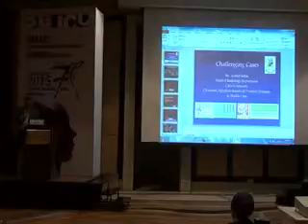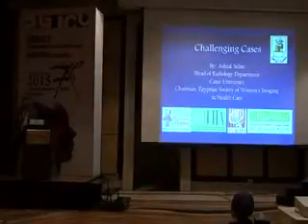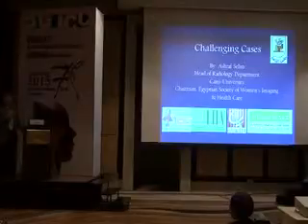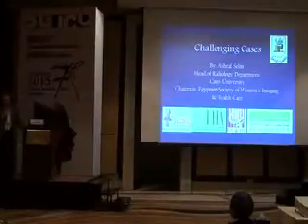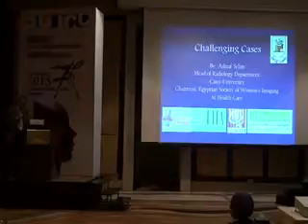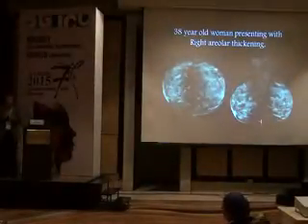My presentation today would be basically centered on the MRI, and I've heard lots of debates today that I didn't want to really take much of your time on. So I said to myself I would answer all that has been discussed yesterday and today from my perspective. And let's go for the first case.